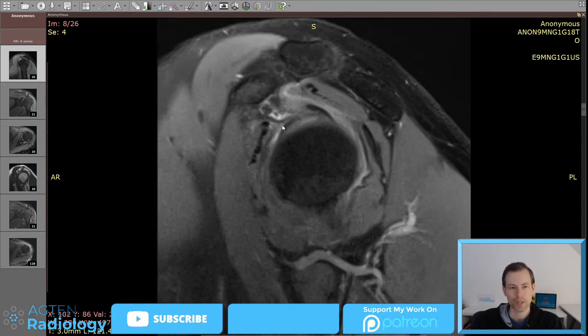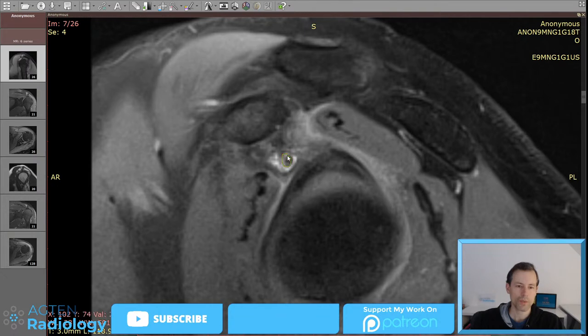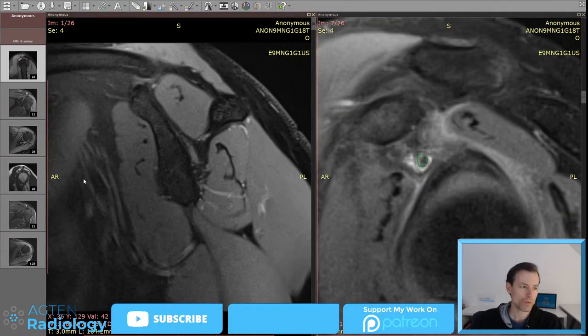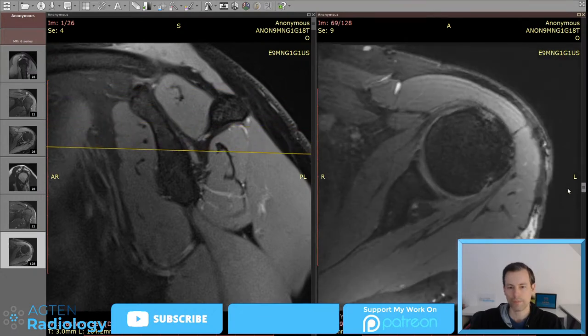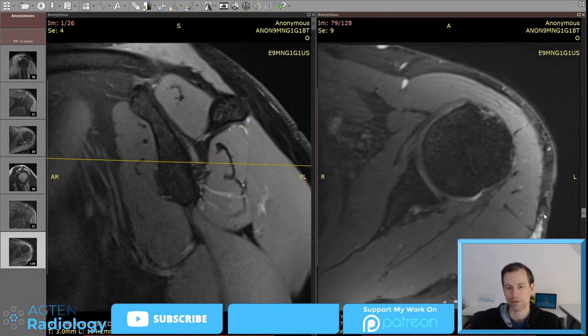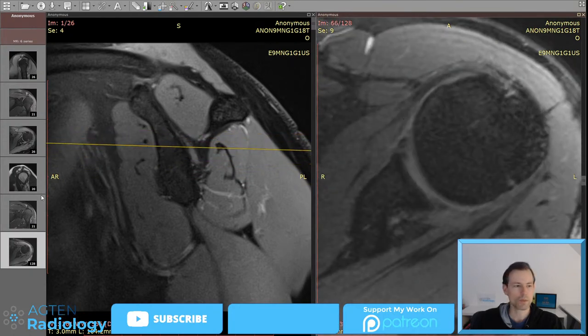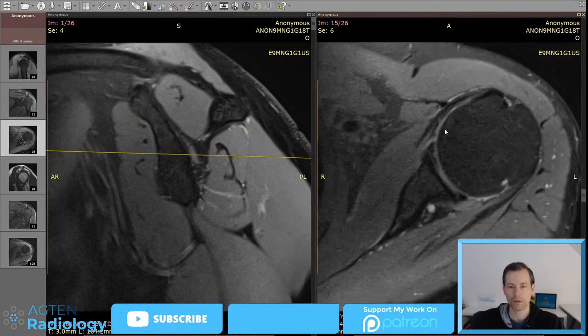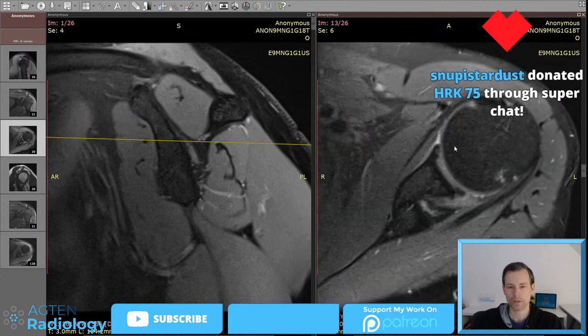And then, yeah, you can also see these loose bodies up here. Whenever you see something like this, the question is, why do they appear? Does the patient have, I don't know, some chondral defects? We can try to figure this out. So let's see here. If we go on the joint, we don't see any major cartilage defects. Unfortunately, this sequence was not really well done, or the patient moved a little bit. These again are the loose bodies.